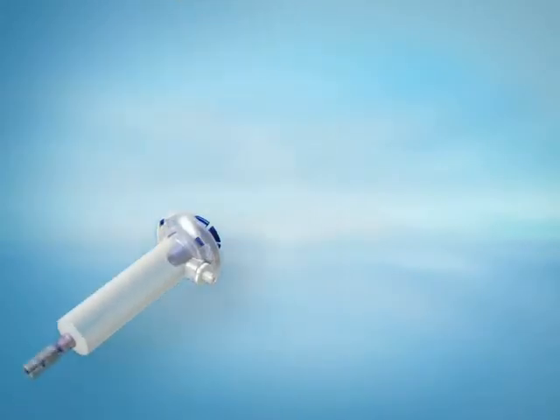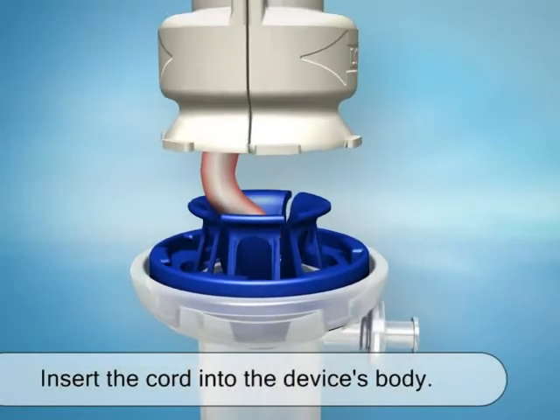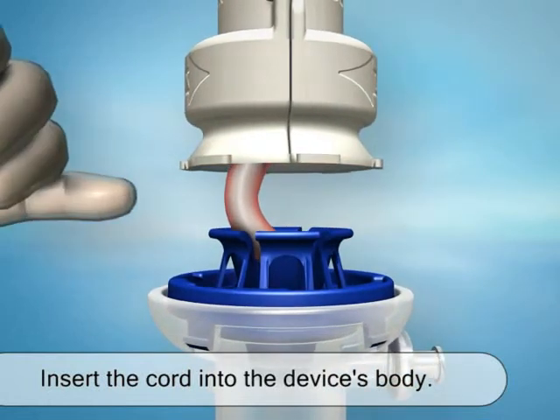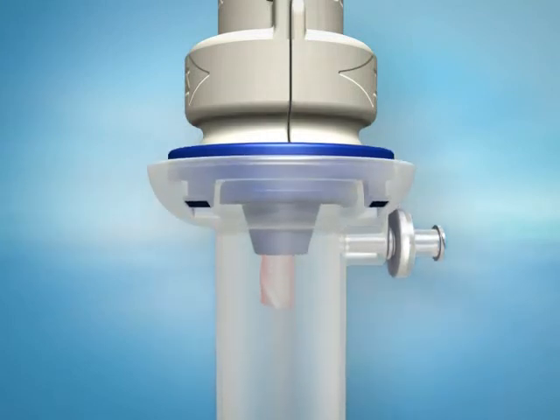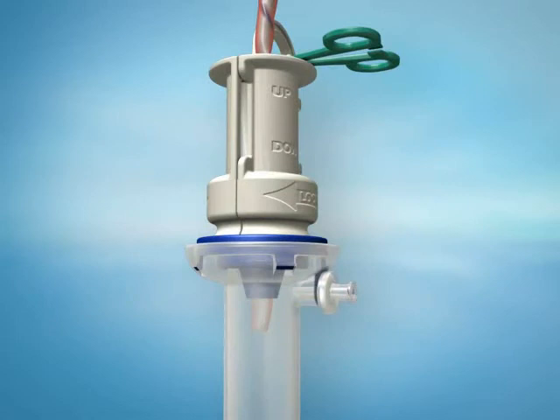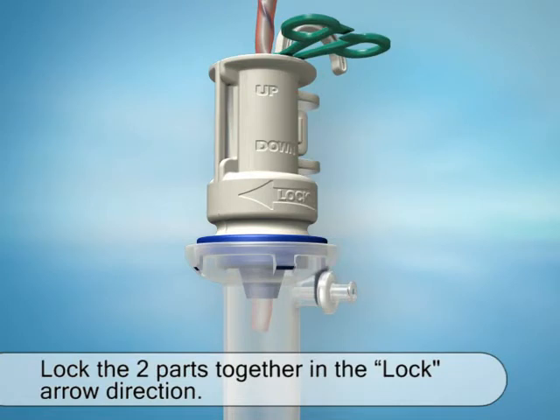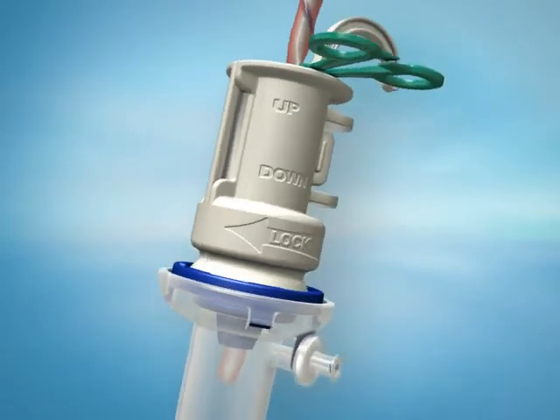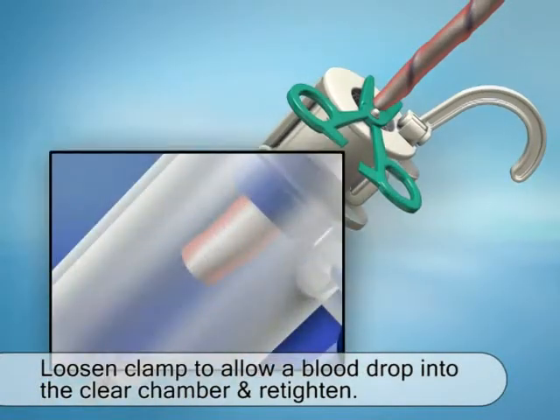Now pick up the lower part of the CITUGEN device from your work surface. Insert the end of the cord into the device's clear chamber in order to connect the two units. If necessary, you can use your finger to push it through. Make sure the end of the cord appears in the clear bottom chamber. Lock the two parts by turning the top part in the direction of the lock arrow until it locks into the teeth of the lower part. Now slightly loosen the clamp until you see a drop of blood entering the clear chamber, then quickly re-tighten the clamp.